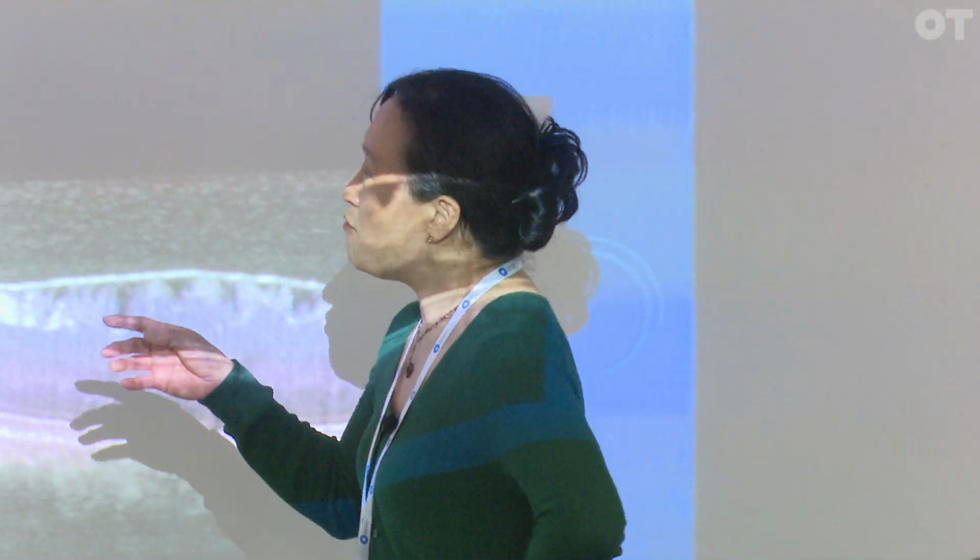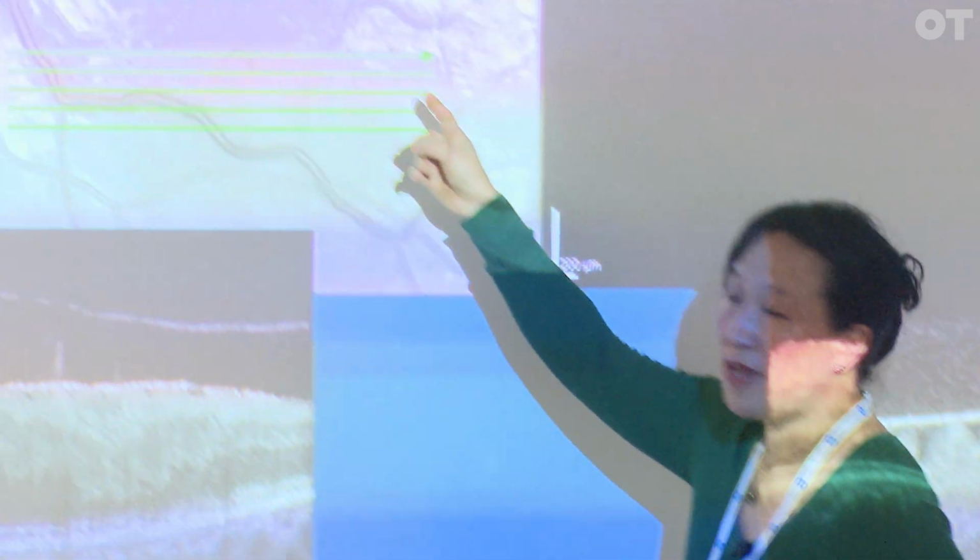So today I was asked to present a workshop on OCT, which is a core skill now, it seems, for many optometrists because it's becoming so much more widespread. Showing a patient a picture and saying to them, well, actually, your retina should be a smooth surface, but it looks like that. A picture is more than 1,000 words. And if you explain that actually it's like looking through creased cling film, they'll understand why their vision isn't as good quality as they would like it to be.